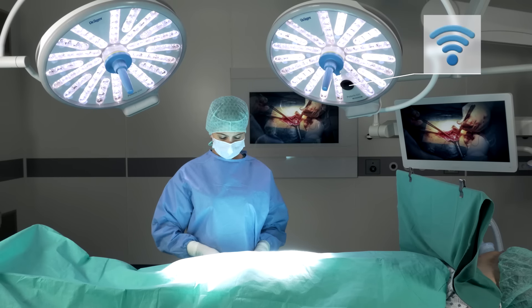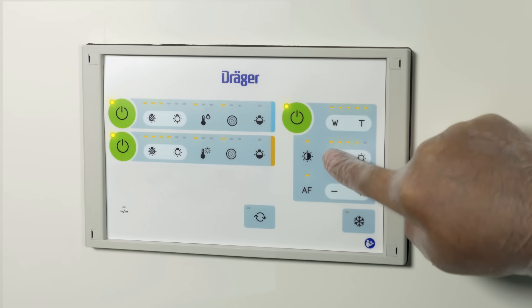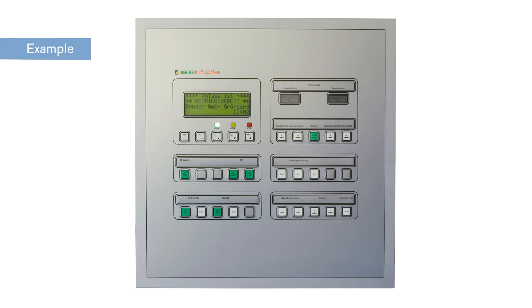All functions of the Polaris camera can be controlled hygienically by non-sterile staff using the remote keypad, wall-mounted control and wall tablet.